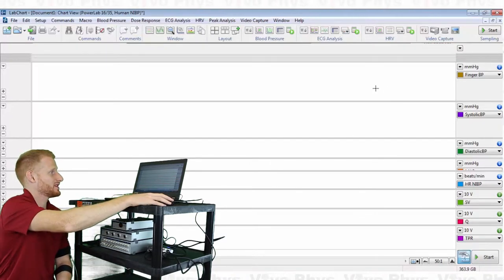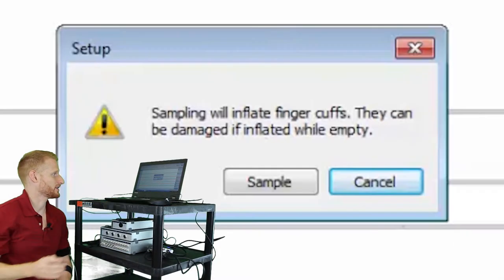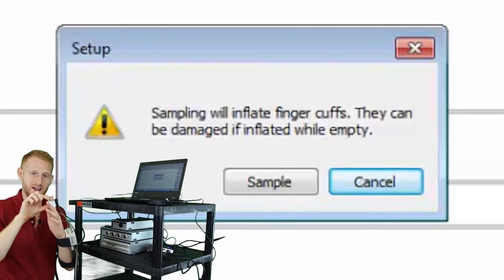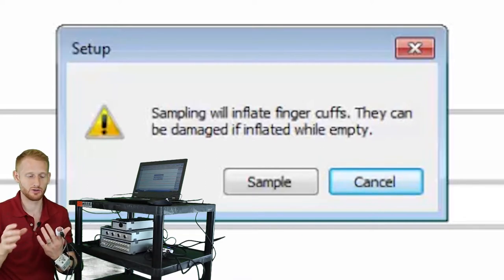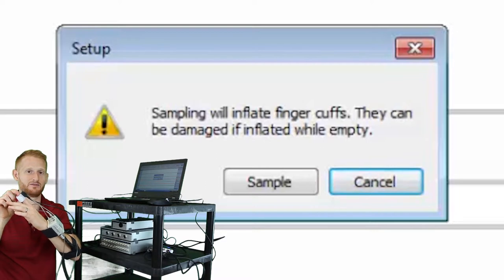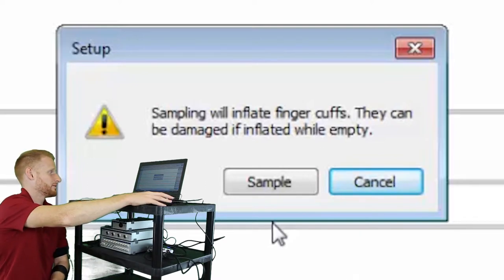Everything is set up at this point, so hit Start to begin recording data. A warning will pop up saying that sampling will inflate the finger cuff — this is important: never run this with a finger cuff connected to the wrist unit unless there's a finger inside the cuff, because it will inflate too much, potentially causing the air bladder to explode and damaging the expensive cuff. My finger's in there, I'm all set up, so I'll hit Sample.